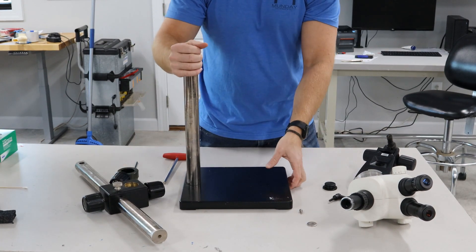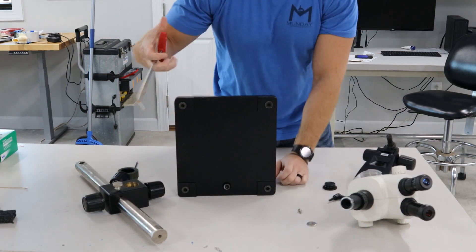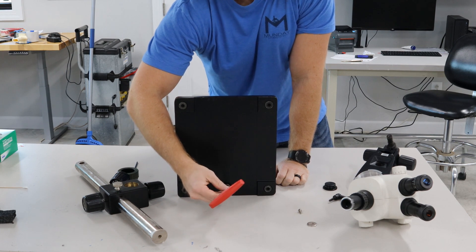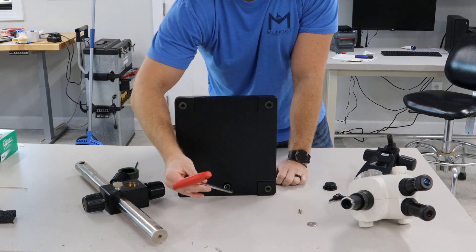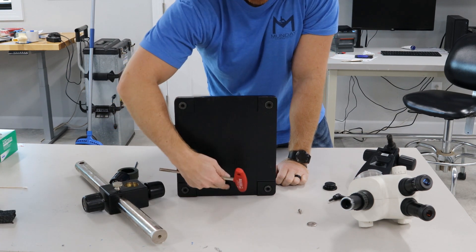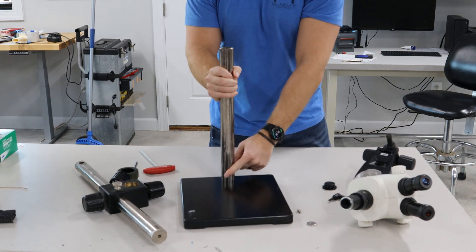Slide that off, and then the last part — this screw right here is a 10 millimeter. I've got an 8 right here but it's actually a 10 millimeter, and we send that in the boxes when we ship it. You would just loosen this and take that bolt out and this post would come right off.